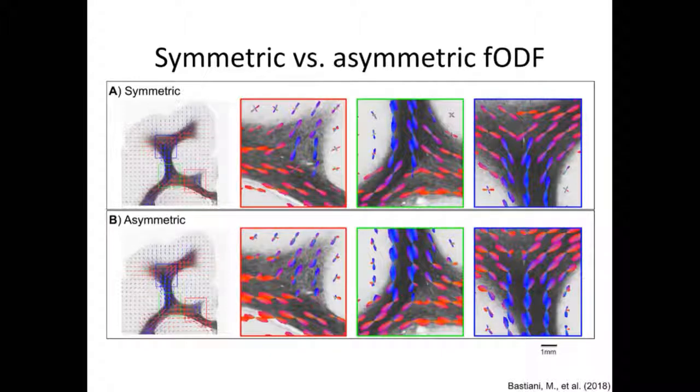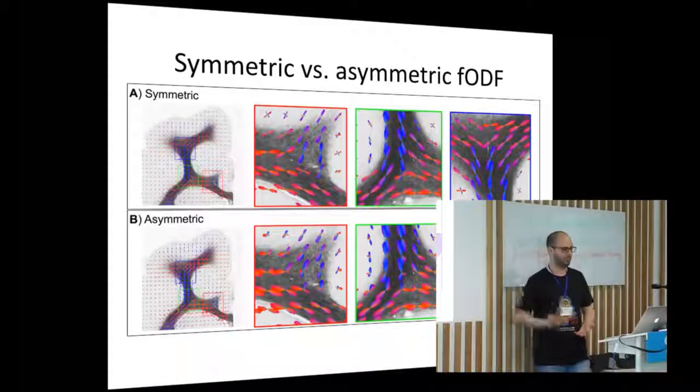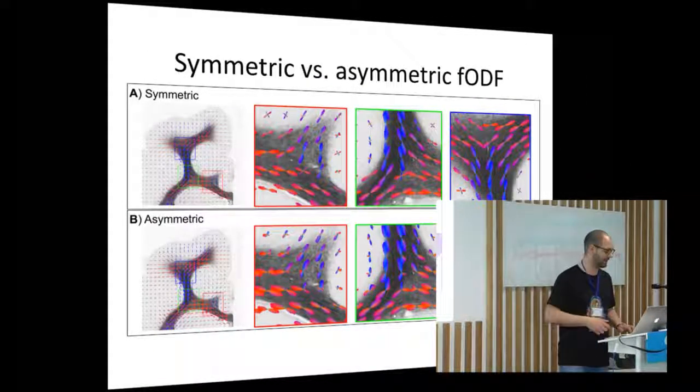And here is the different answer in 3 different ROIs on a myelin histological stain, an actual post-mortem stain in which you can see where the axons go to. Those are the spurious or insufficient results that the symmetric analysis will give you, while if you use the asymmetric model, which is, again, just a simple modeling like we had the ball and stick before, you have the sharp bends here, but you also have the fiber fanning, correctly fanning there. So once again, different modeling approach, different answers, but they can help you when it comes to improving your tracking results.